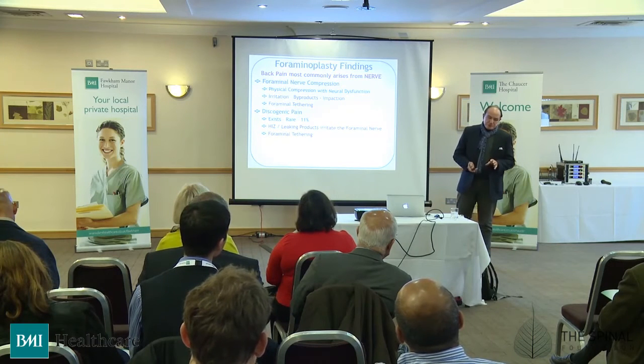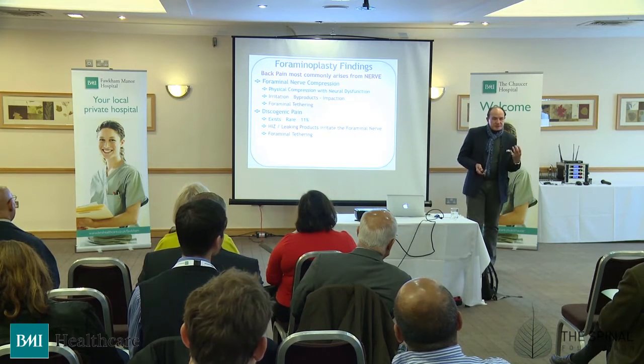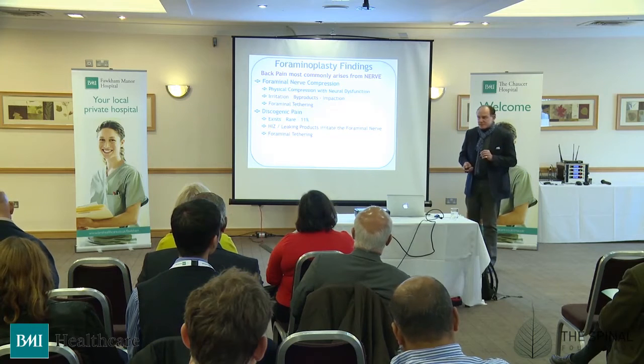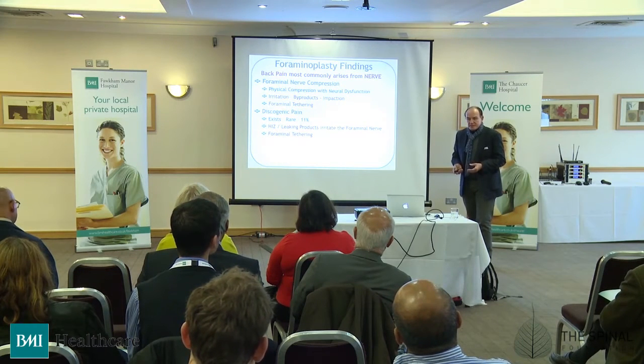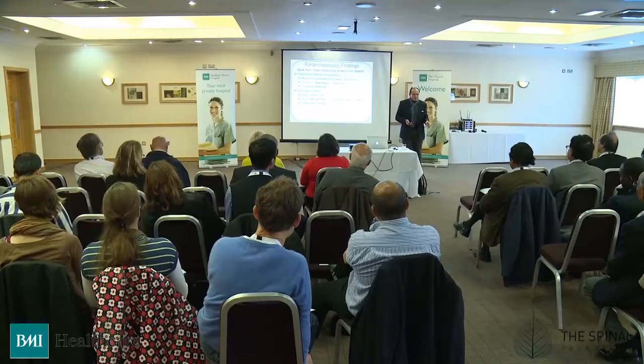Then there is true discogenic pain. Sometimes you touch the disc and it's highly inflamed. You can see that there are injected vessels, there's angiogenesis in the wall of the disc. But in our patients, it's only about 11% of them in whom you can reproduce that. I think you're all thinking about, oh, discography. Discography causes pain. That's surely the cause by the disc. No, discography distorts the disc and then presses on the nerve and then causes your nerve-derived pain.